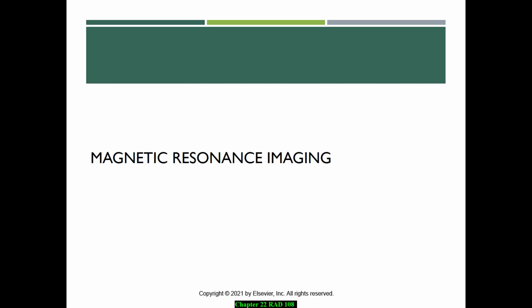MRI is another one that you're probably pretty familiar with, and I do have some more videos for you to take a look at with these. MRI is, again, a non-invasive diagnostic modality. It does not use ionizing radiation, so it's operating off of powerful magnets that are going to produce a radio frequency pulse that's going to be produced into a radio signal in the body that can be detected electronically, and it provides the images to the computer monitor. So that's going to be digitized, and it's still sent off to PACS just like regular radiographs are, but the equipment is going to be different.